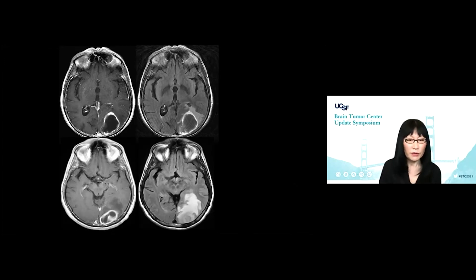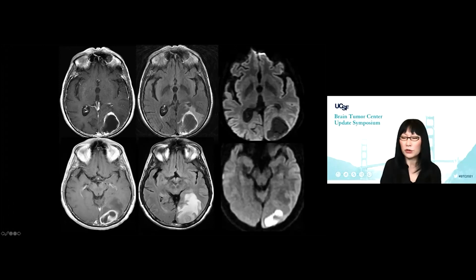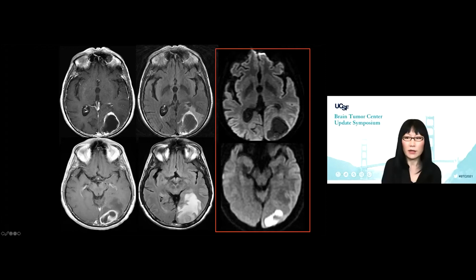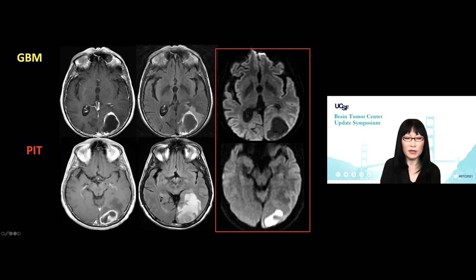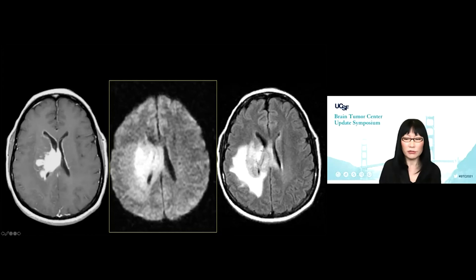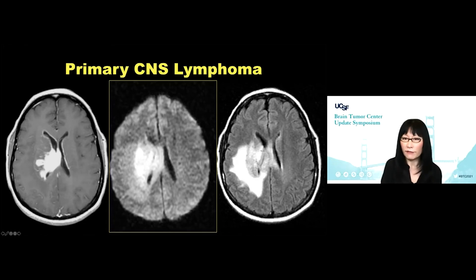Two different patients, very similar looking on post-contrast and FLAIR. Once you add DWI, there's no mystery: the patient at the top has glioblastoma, the patient at the bottom has an intracranial abscess. How about this patient? Post-contrast, FLAIR, diffusion is homogeneously reduced — this is a primary CNS lymphoma.